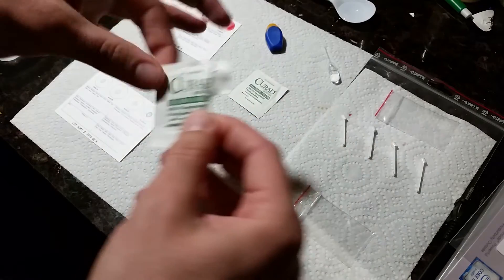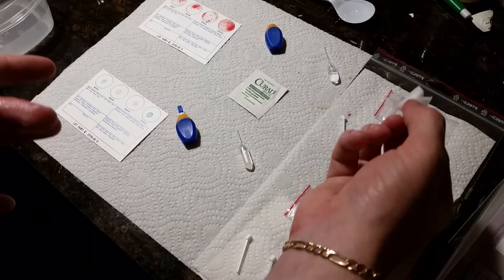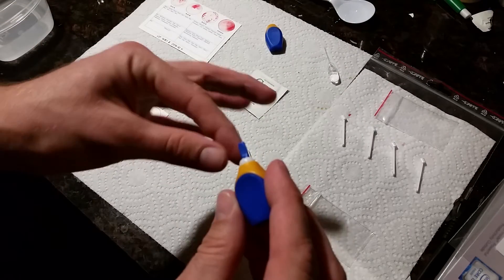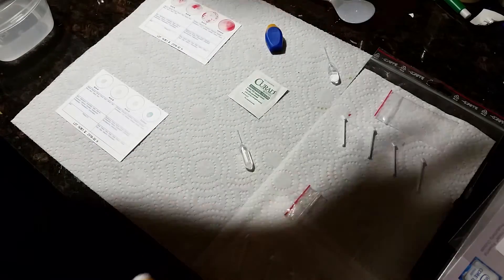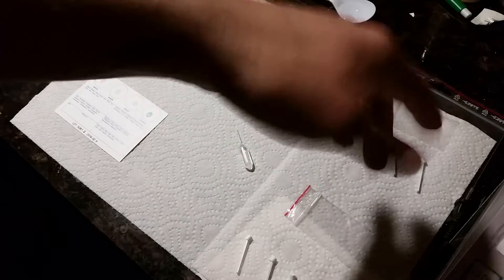Notice how I didn't touch the paper with the dropper head — kept it hovering. My middle finger is next. Just going to rub it clean. Make sure that dries — you do not want alcohol on that stuff, it will most likely ruin everything. Now these lancets: mine are blue, yours may be green. Just twist and pull and the stem comes out. You will not feel the needle.